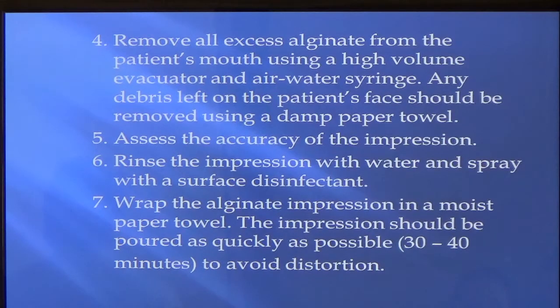You're just trying to prevent it from drying. If you just leave it out in the air while you're doing all your other work, it is losing moisture. As the material loses water, it starts shrinking. So just leave it wrapped in a little paper towel.